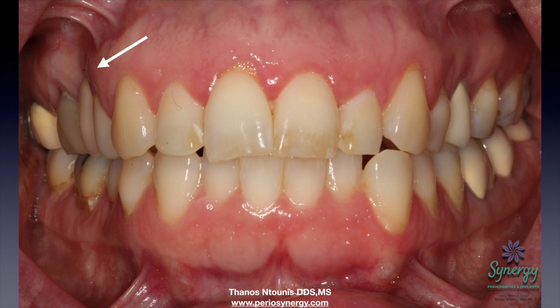In this particular situation, the restoration in question is the second premolar on the upper right, and you can see also the extent of that crown. It's made in a way to mask, at least that was the understanding I feel from the restorative dentists at the time, the significant deficiency in soft and hard tissue around an implant. It has a subtle shape defect.